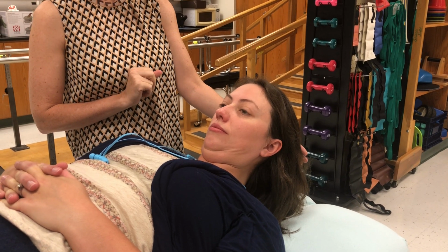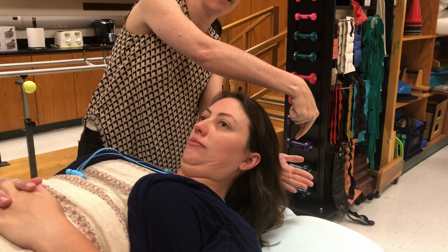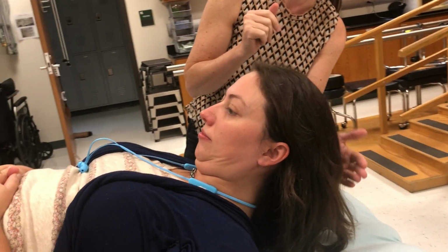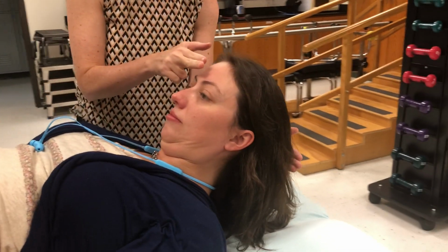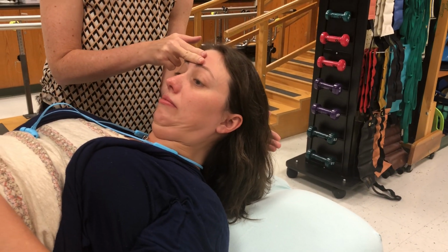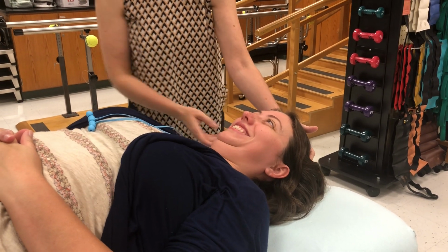Don't let me do it, stay strong. Use 2 fingers for cervical flexion. And my other hand, if you can see this, the stabilization hand is not touching her, but it's back at the occiput in case she can't tolerate. So stay strong, stay strong. There's 4 and there's 5. Good, take a little break. I know that was a lot.